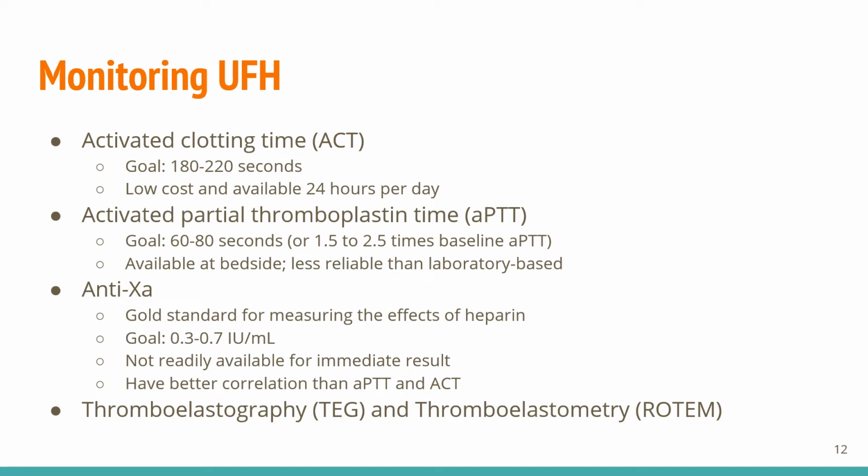thrombocytopenia, or dilution status. And I want to caution that this assay requires antithrombin level, so it is important to consider antithrombin deficiency when anti-10A concentration are not rising when the dose of heparin are increased.